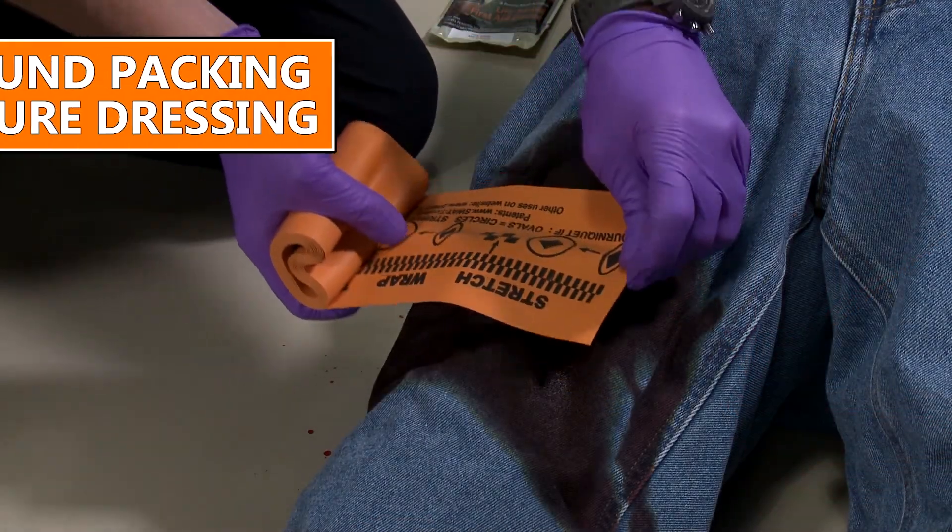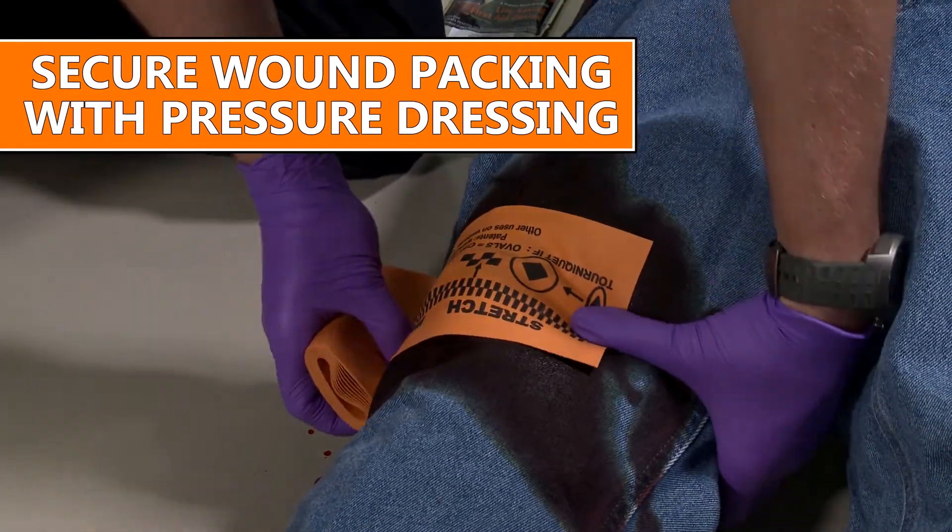And finally, you'll want to secure that packing with a pressure dressing of some kind. This isn't as hard as it sounds, and your definitive and confident actions can help to save a life.